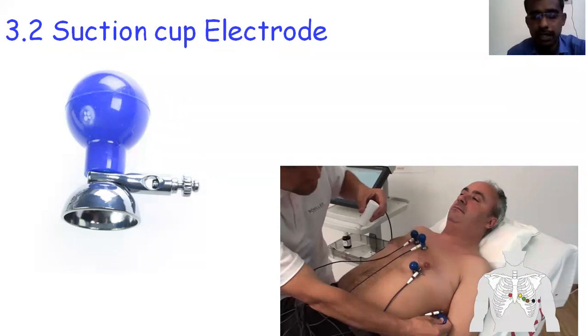In most cases they use surface electrodes, either type of surface electrode, not disposable ones, more often. Maybe it is a more intensive problem. So in order to avoid slippage, they have kept it. There is an electrode here, they have kept it. This is just a sample. It works on the suction principle, but the signals are picked up from here only. A simple metal picks up the signal and that's how you receive it. There is no rocket science involved, right?